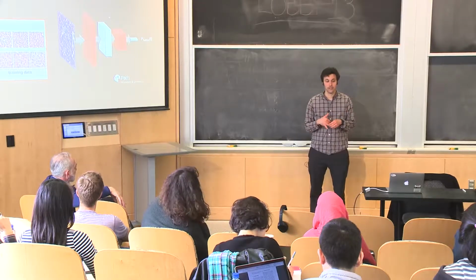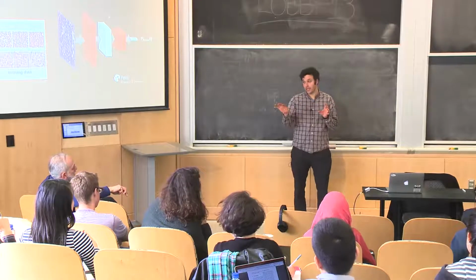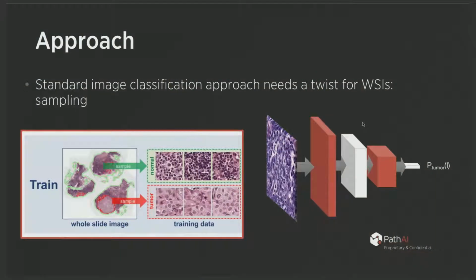Yeah, definitely. You mean within a sample? Within a slide. Yeah, you mean a continuum of aggressiveness. Yeah, I think it is a continuum. This is more of a binary task, but there are going to be continuums of grade within the cancer. That's another level of adding on. If we wanted to correlate this with outcome, it would definitely be valuable to not just quantitate the bulk of tumor, but to estimate the malignancy of every individual nucleus, which we can do also.